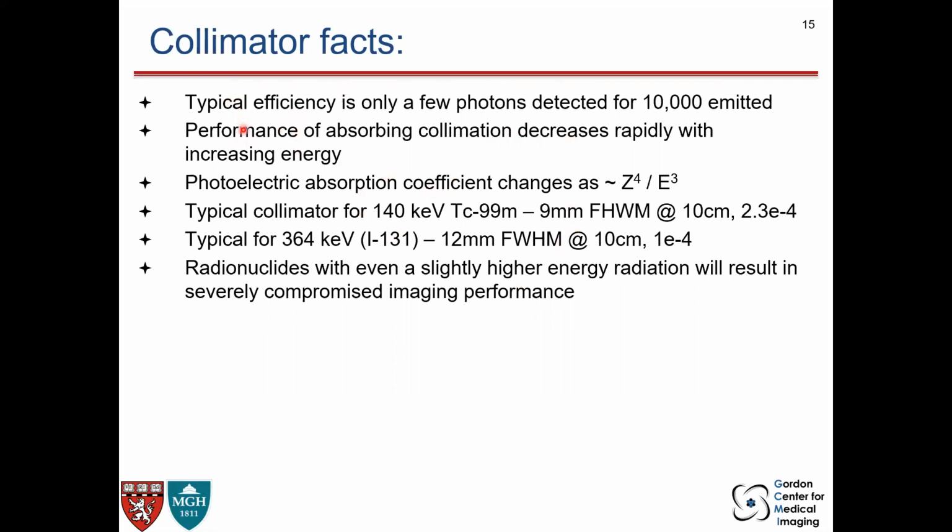And again, the collimator depends on what type of material you're using and what type of energy. Typically, it's a function of the energy, the distance, and the collimator physical properties.